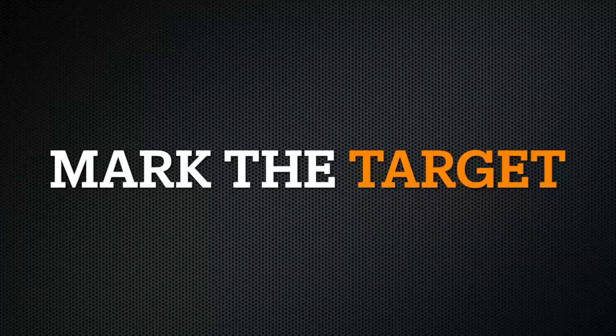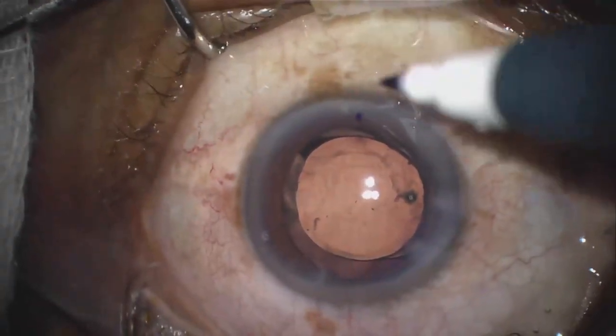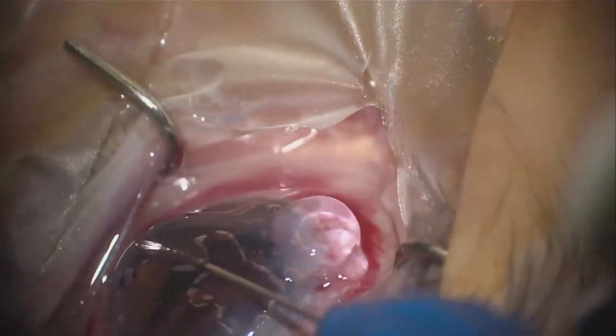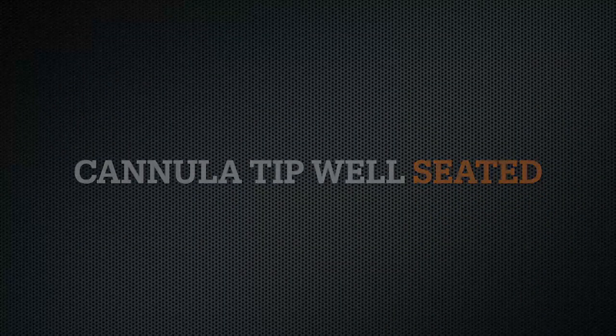Starting at 3 to 4 o'clock hours from the corneal entry site, which I like to locate and highlight with a marking pen for easy identification when inside the eye. Making sure that the AC is not overinflated with viscoelastic, which can flatten Schlemm's canal and make entry more difficult. And making sure that the cannula's beveled tip is advanced through the TM and is well-seated in Schlemm's canal, with the TM visible over the beveled tip of the cannula of the Hydrus Micro Stent delivery system, before advancing the tracking wheel to insert the Hydrus Micro Stent.